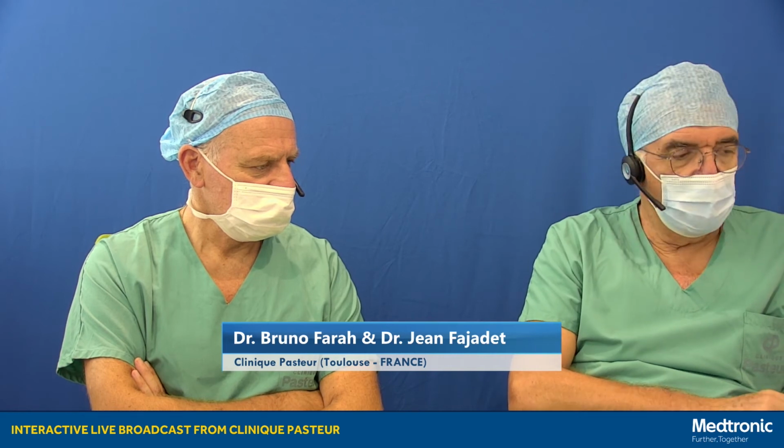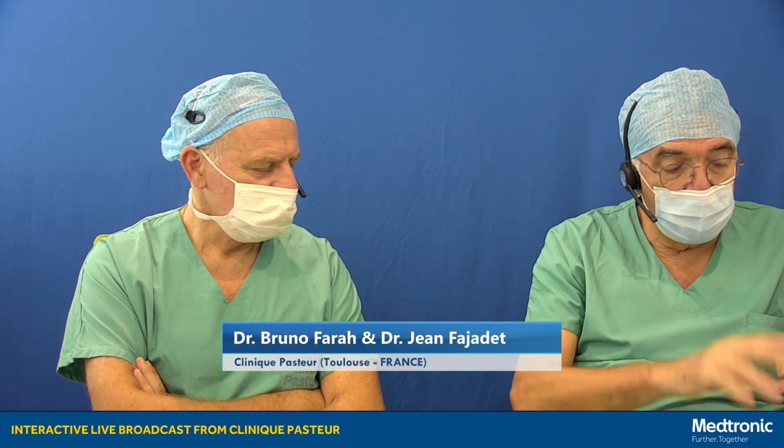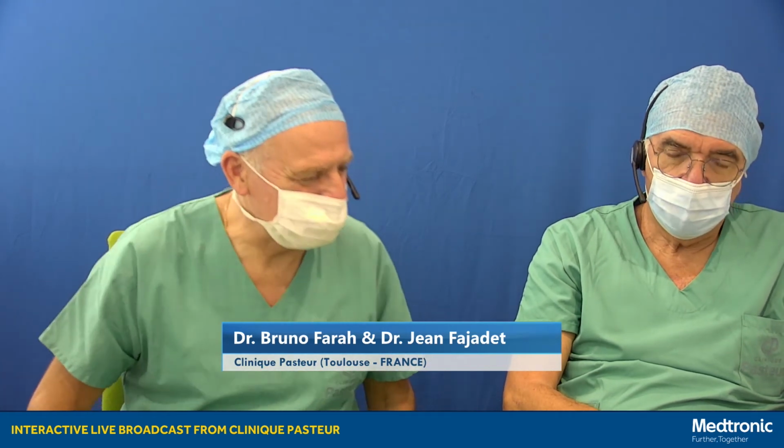So I think that in this case it's better to perform kissing balloon. You cannot compare a single versus the kissing balloon. But it depends really on the size of the side branch, the angiographic result that we obtain after the stent implantation in the main branch, and the territory of this side branch. And your personal experience, because sometimes you have not done the kissing and the patient comes back with some angina. So the next time you will do the kissing. Sometimes personal experience may change the game a little bit.